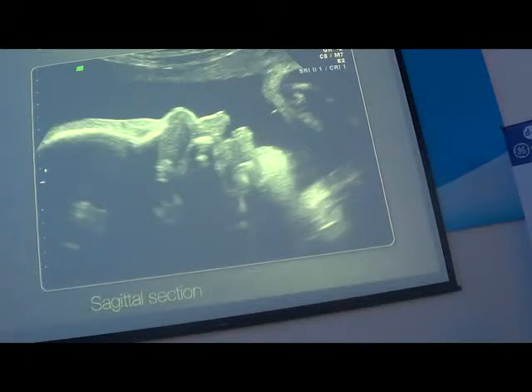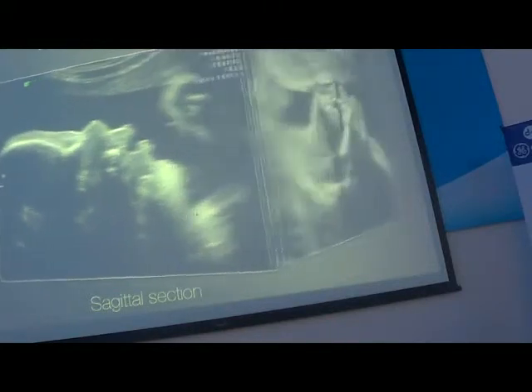If you want to look at the palate inside this volume, it will not be possible because you have here shadowing and it's not possible to find the palate inside this volume. In 2D too, it is sometimes difficult because of the shadowing of the maxilla.